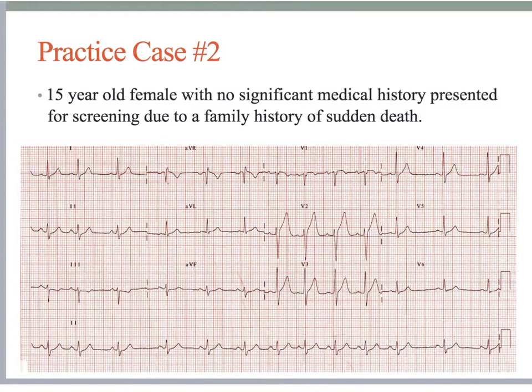Let's end this presentation with another practice case. This is the EKG of a 15-year-old female with no significant medical history who presented for screening due to a family history of sudden death. Again, look at the calibration, rate, rhythm, axis, and intervals.